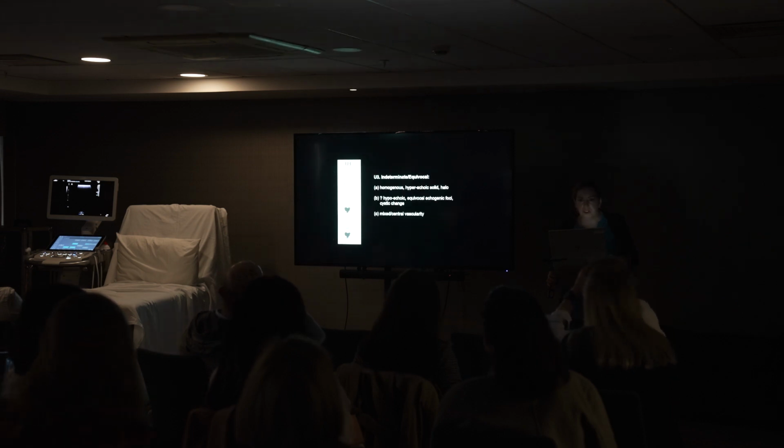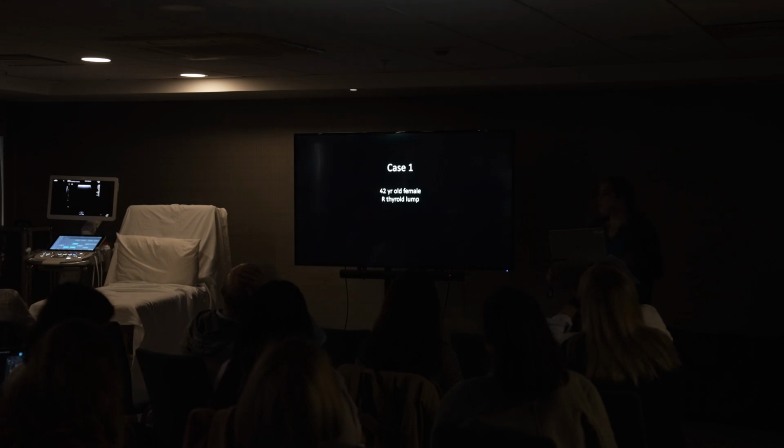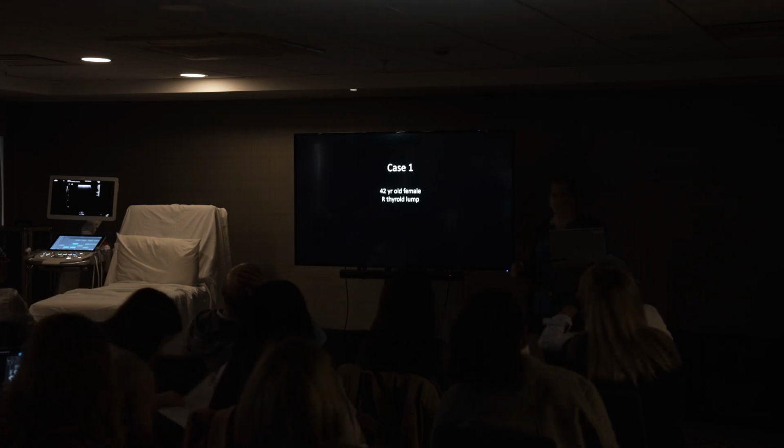Going to just get on with some cases basically, because I once went to a thyroid talk and they didn't show any images, so I was really disappointed. So I'm going to show loads of images. I'll just try and get through as many as I can, we've got the cytological and histological correlation for most of them. So there is some paper around.